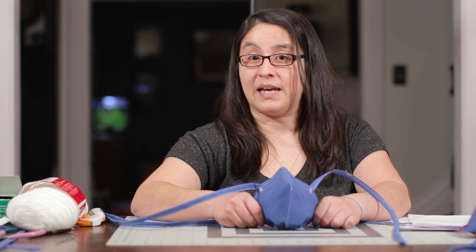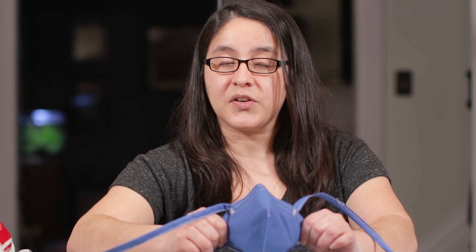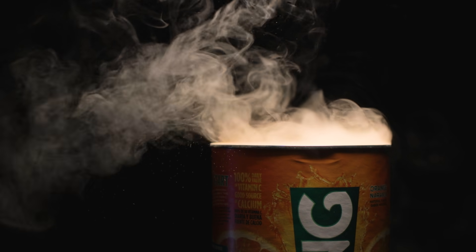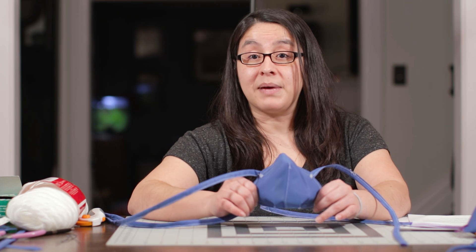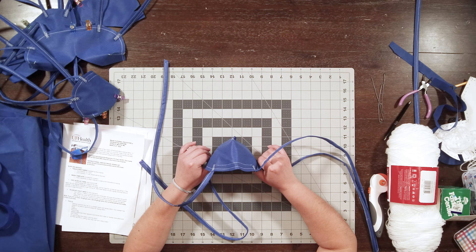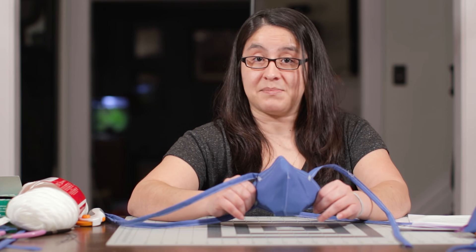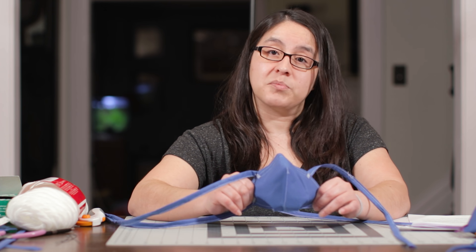My husband used to do hazmat at a university and one of his responsibilities was fit testing, so he helped me do my own fit test at home. As a substitute for saccharin we used Tang — when you open it you get powder in the air and everything tastes like orange. Unfortunately my mask did not pass the fit test. That could be for any number of reasons: fit, construction, or the material itself. But it did not pass, which means it is not appropriate as a replacement for an N95.